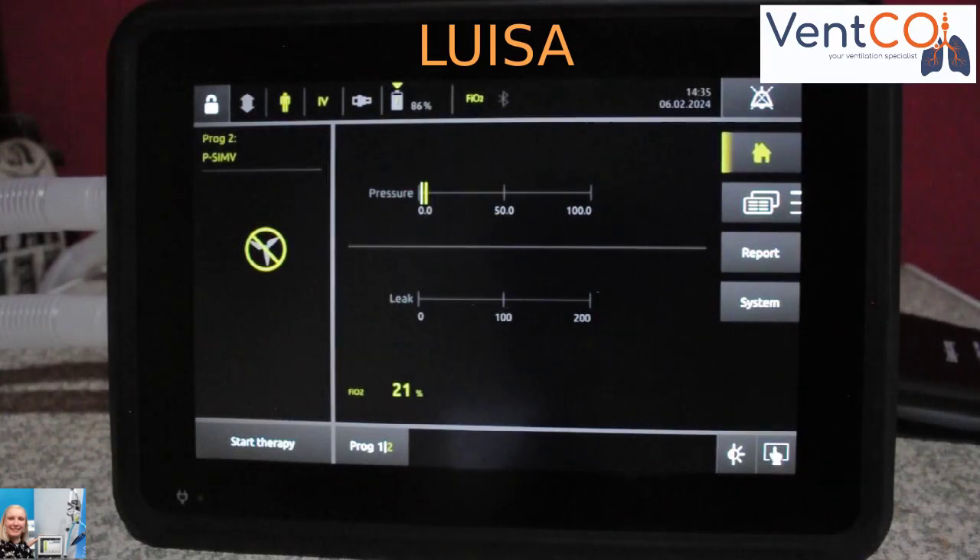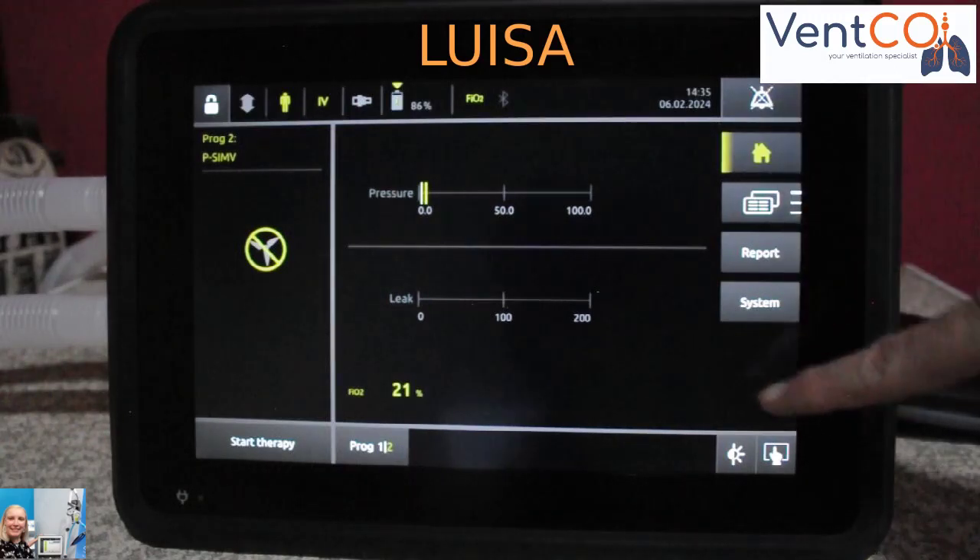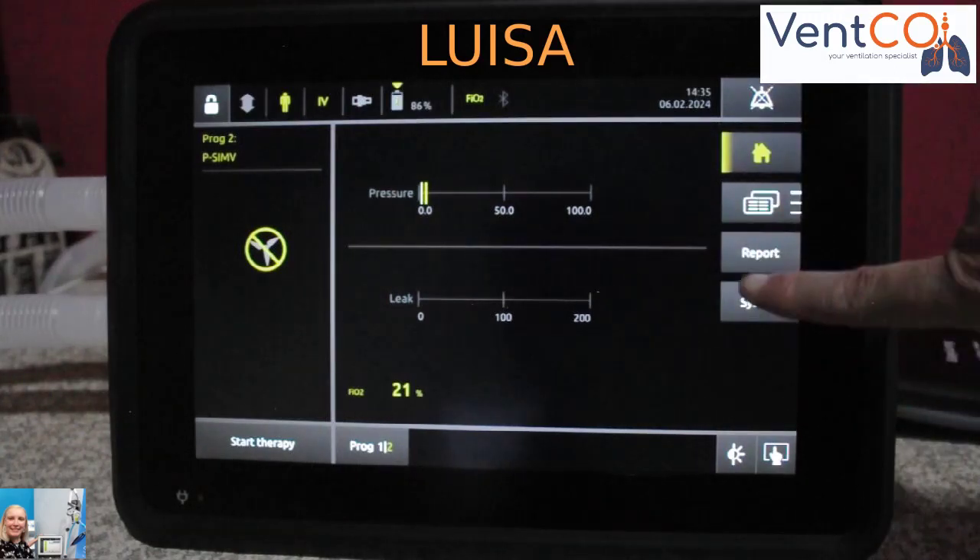The Luisa is very easy to operate. It has a 10-inch touchscreen with intuitive menu navigation.